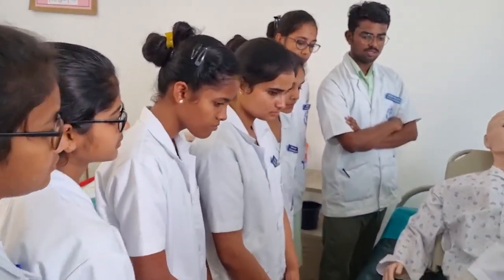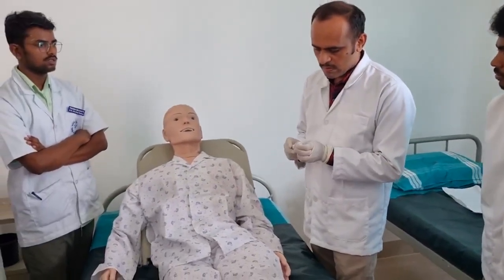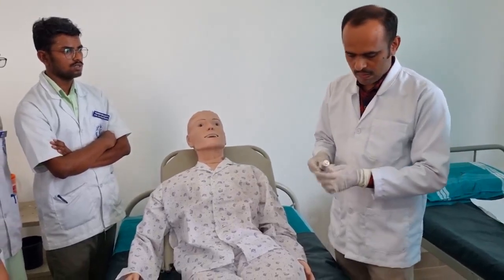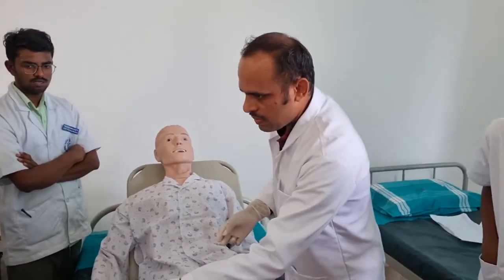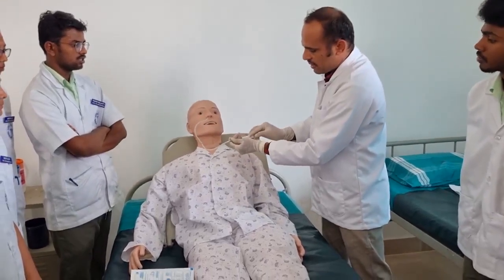So first we will lubricate the NG tube. We lubricate the NG tube and make sure that the patient is in upright position, and we'll start the procedure. Then we have to aspirate the NG tube.